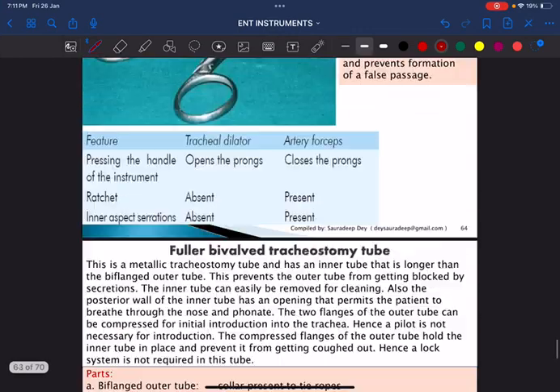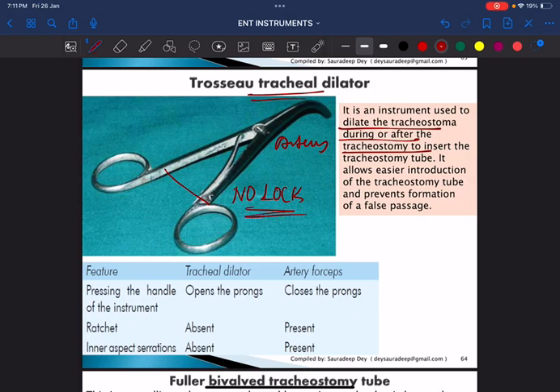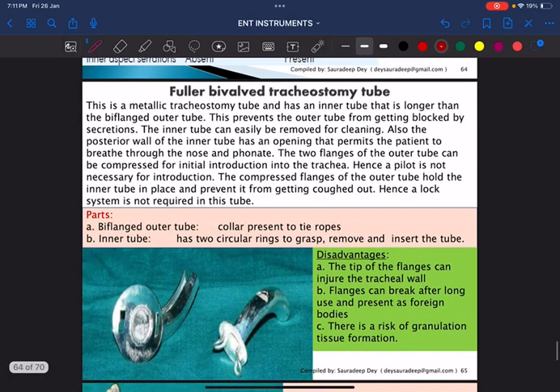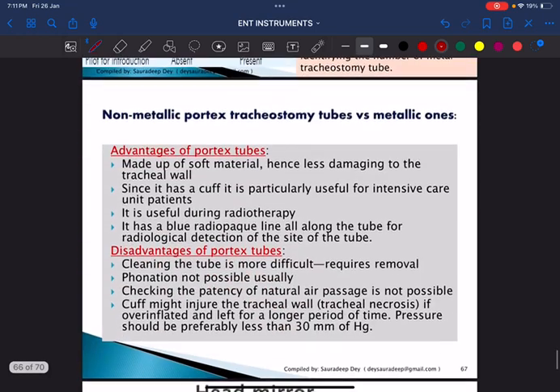This is the Trousseau tracheal dilator, used to dilate the tracheostoma during or after tracheostomy to allow insertion of the tracheostomy tube. It looks similar to curved artery forceps but the key difference is there is no ratchet for locking. Note: Fuller's bivalve tracheostomy tube and Jackson's tracheostomy tube are no longer in use; the current standard is a portex non-metallic cuffed tracheostomy tube.